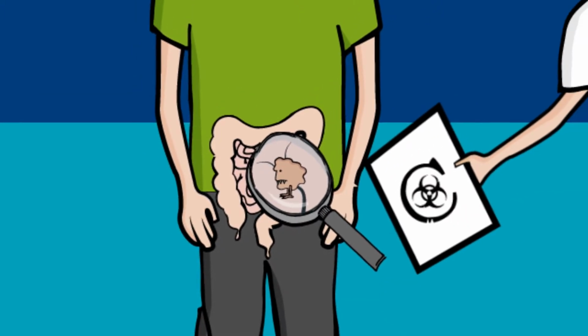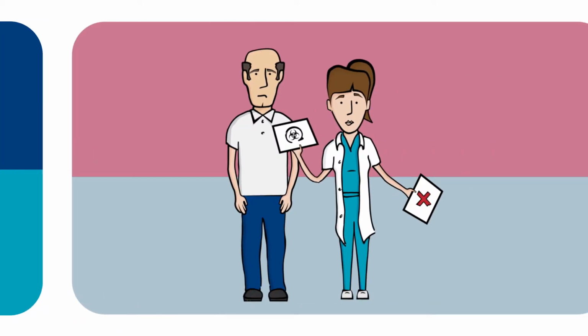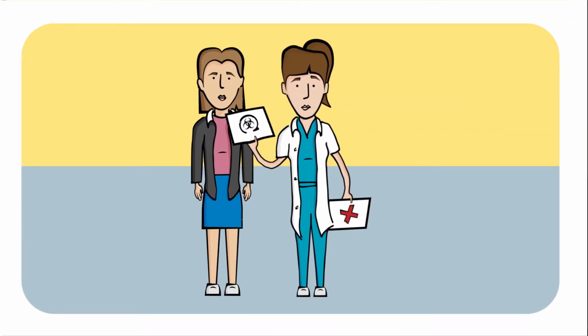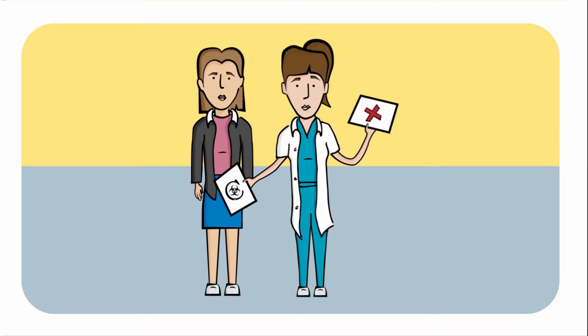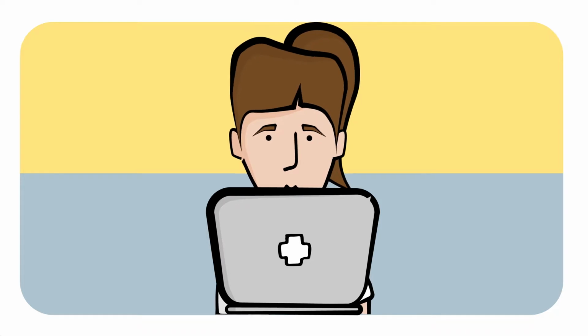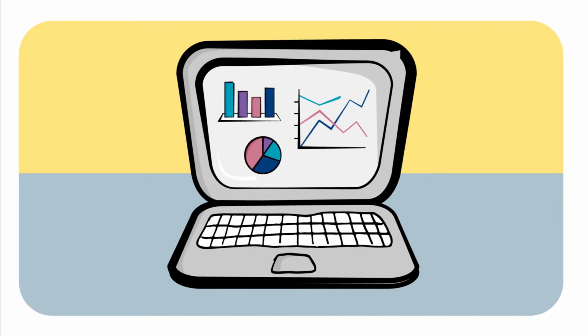But we also believe that doctors will be able to determine more accurately whether or not patients should receive chemotherapy, thus resulting in less overtreatment or undertreatment. The LUMC has developed a method for determining the TSR. In this e-learning, we will gladly explain to you how it works. Your data will determine whether the TSR can be added as an extra indicator.